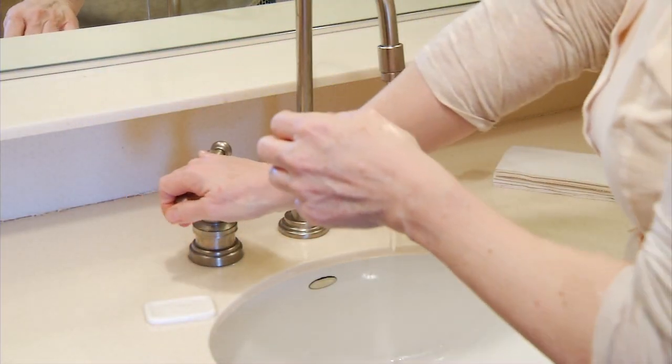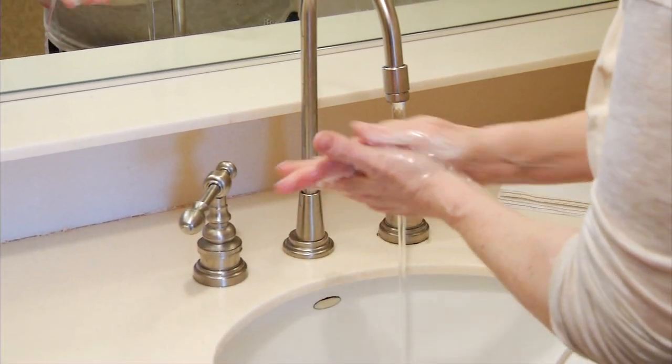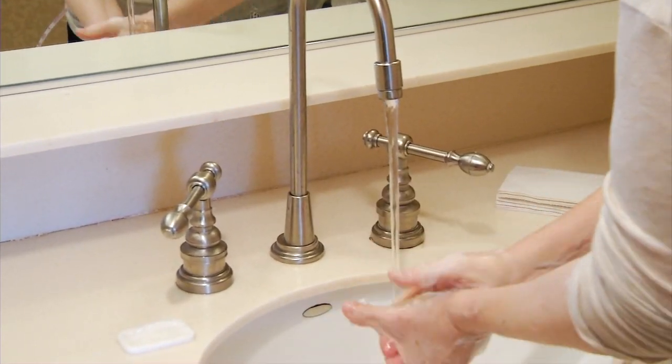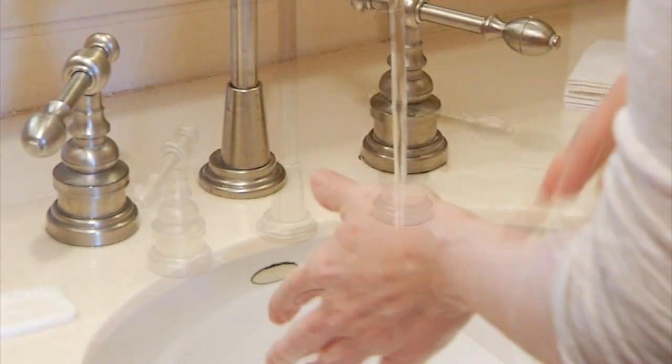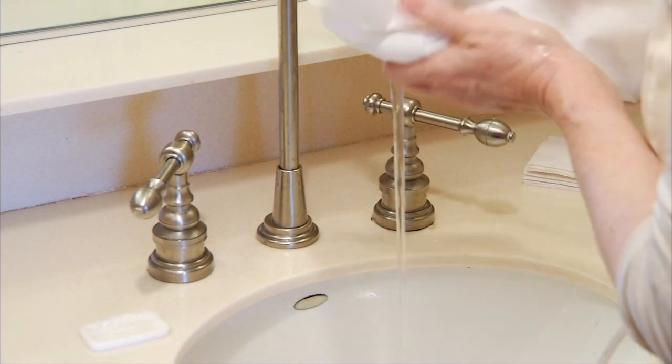First, clean your hands. If you're washing your hands with soap and water, wet your hands, apply soap, rub your hands together thoroughly for 15 seconds, then rinse. Dry your hands with a disposable towel and use that same towel to turn off the faucet.